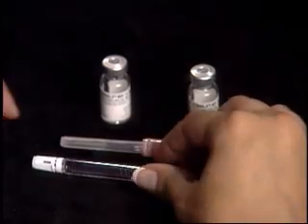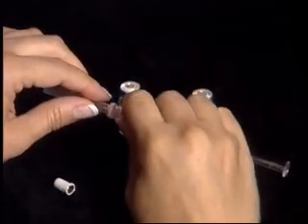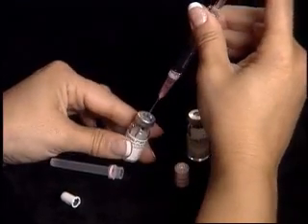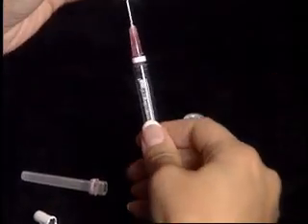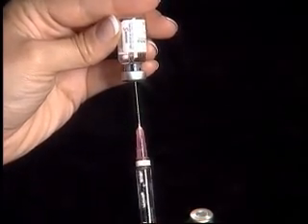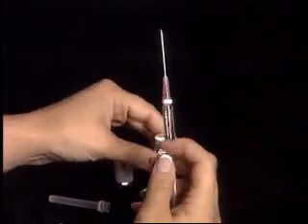Remove the plastic cap from the end of the pre-filled syringe of diluent. Attach the pink 1½-inch needle by pushing into place. Slowly inject the contents of the pre-filled syringe into the vial of powdered medication. As one complete unit, turn the vial upside down so that the tip of the needle stays below the liquid level, and pull back on the plunger to withdraw the entire contents.